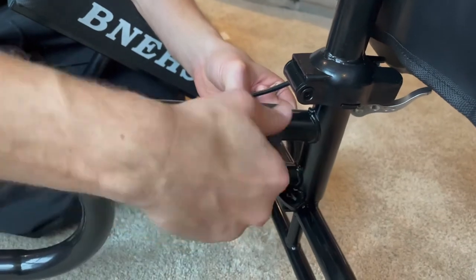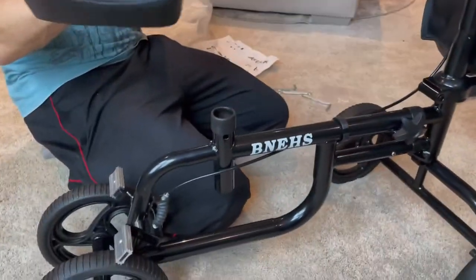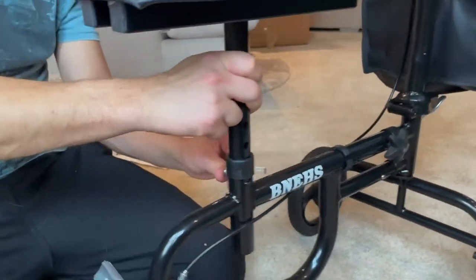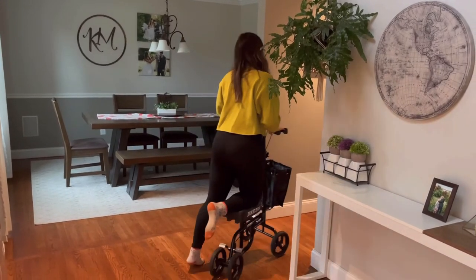As we finish up the installation of this knee walker, I just wanted to reiterate how easy it was for me to be able to walk around and do my normal everyday activities even though I had an injured ankle. The knee pad is extremely comfortable, very easy to utilize, and you're able to take it wherever you need to go.